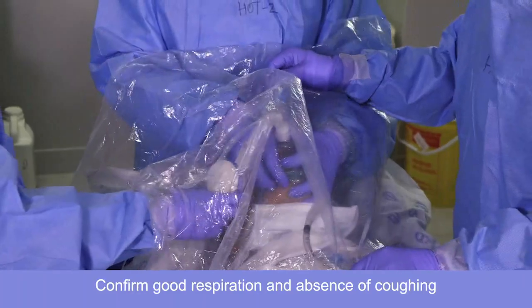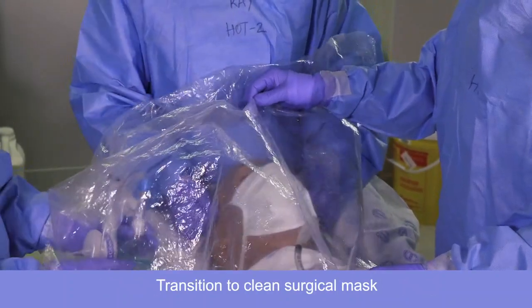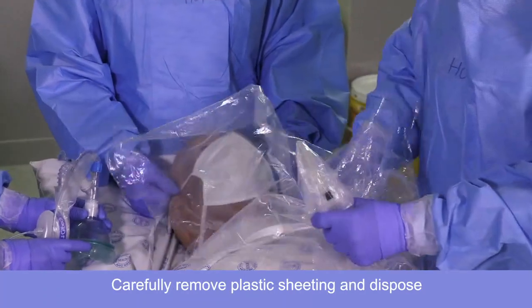Once the patient's breathing comfortably on the face mask, we'll take that off and go straight to the surgical mask. And we're going to remove this plastic carefully so as not to disperse the droplets.